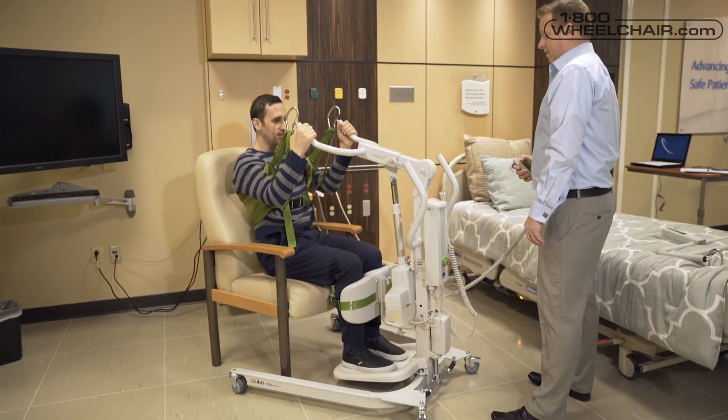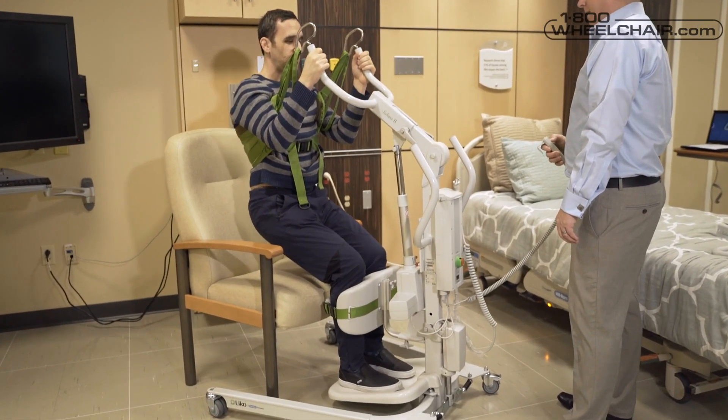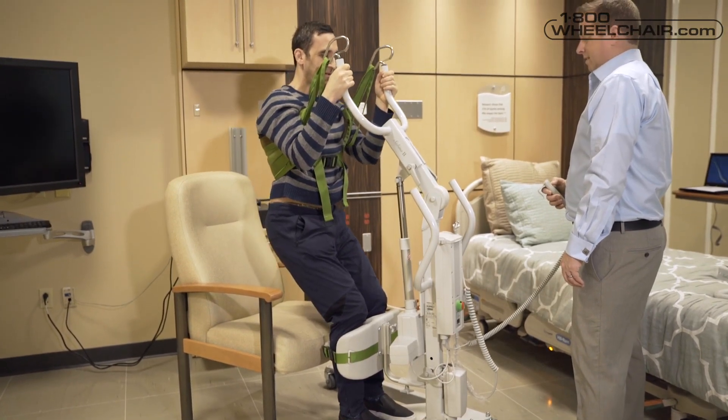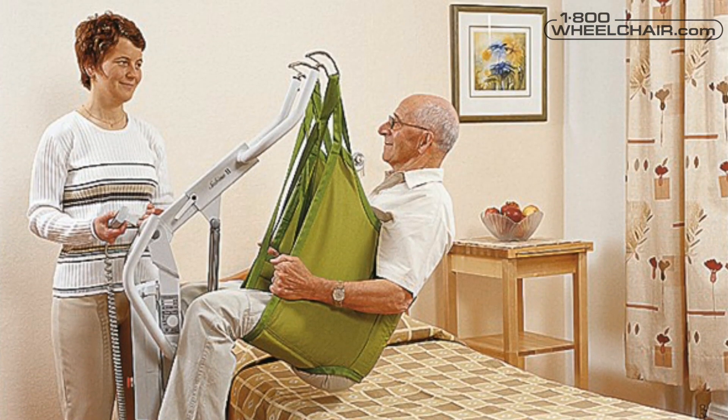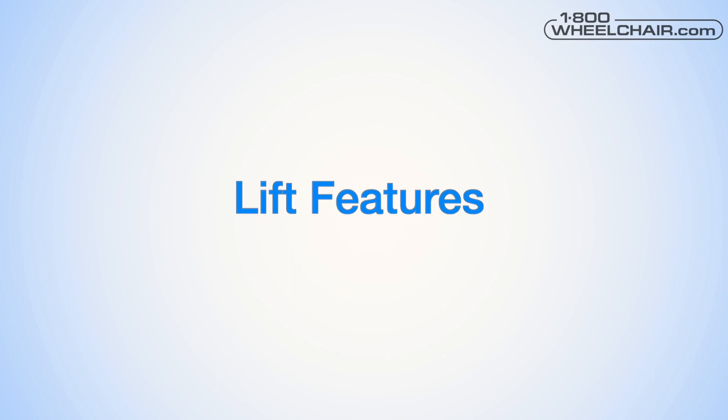A sit-to-stand lift is for patients who are unable to stand on their own. The Sabina will help them go from a sitting position to a standing position. While they're on the Sabina, you can move them either to the toilet or to a chair to sit down. If the condition of the patient worsens and the patient is unable to stand up on their own, the Sabina also acts like a traditional patient sling lift.